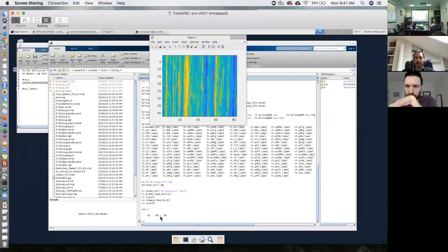the right hemisphere. That huge vector has been converted into a three-dimensional matrix just so that SPM likes it, because SPM doesn't work very well with these volume files that contain just a long vector. But this is basically surface level data. This is in FS average. So the number of voxels that you have here correspond to the actual number of vertices that you have in the FS average space for the two hemispheres.